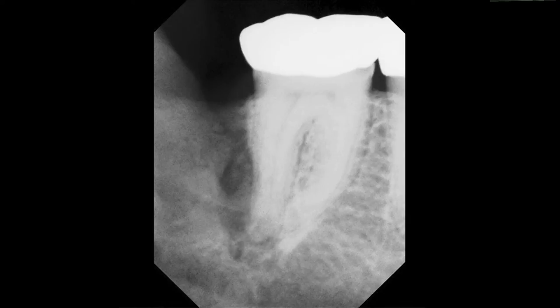Actually, this case has a neoplasm which we picked up on this film, and this patient expired within six months after this film was made. So it's very important to have the entire tooth on the film.